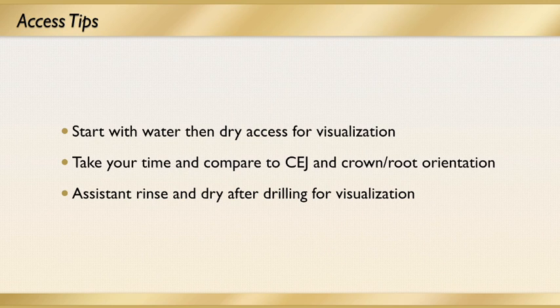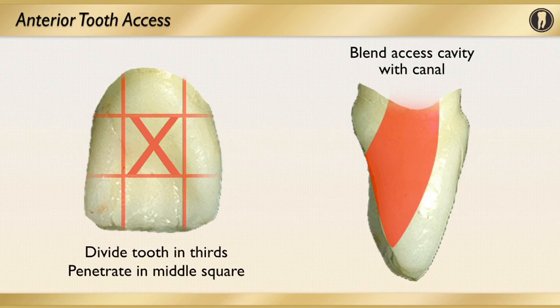I actually take my burr and place it into the access prep, and I look at the facial dimension of the tooth, and I just want to make sure that I'm right on cue. Again, you want your assistant to continually rinse and dry after drilling and taking your small bites out of the tooth.